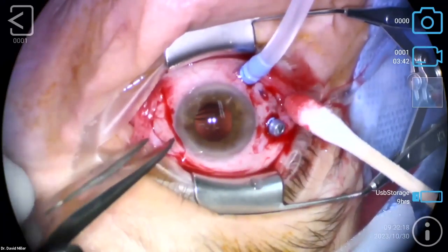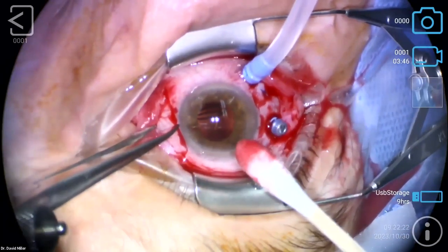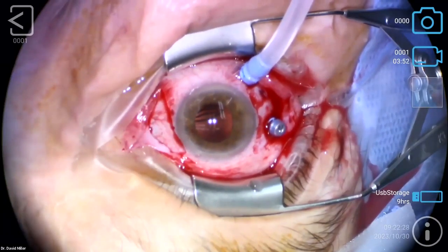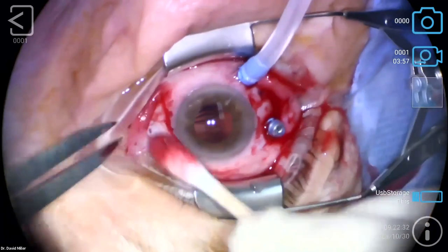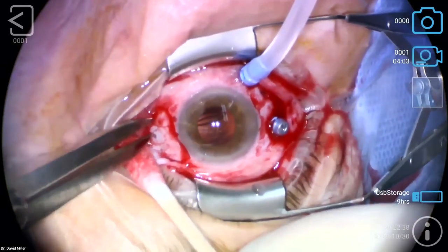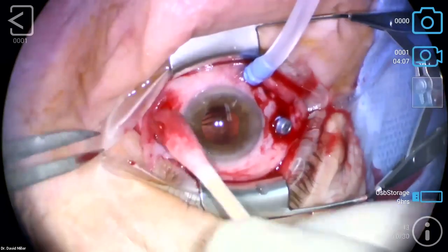I know we were right there. I want to be directly across. And 4 millimeters again, about right there. And we'll confirm it with our eyes before we place the sutures, just again to make sure things are about where we want them. That's the first mark. I'm going to make the 2 millimeter one. I rotate the calipers a little anterior because we know the eye is curving. I try to match that curve. So I end up at 4 millimeters on all of these.